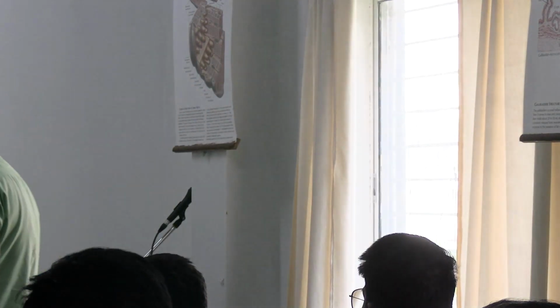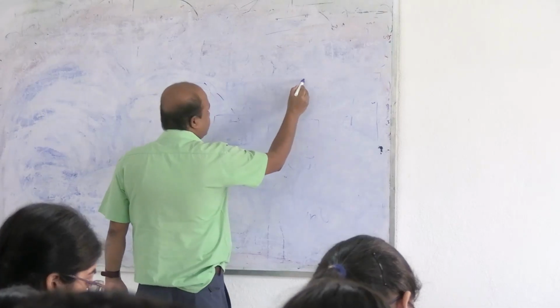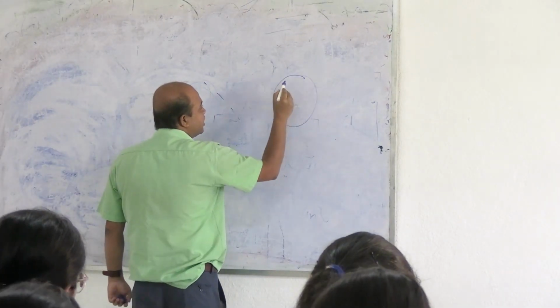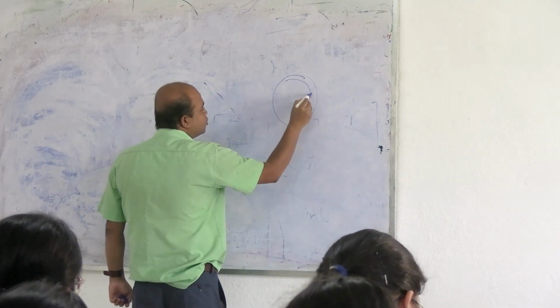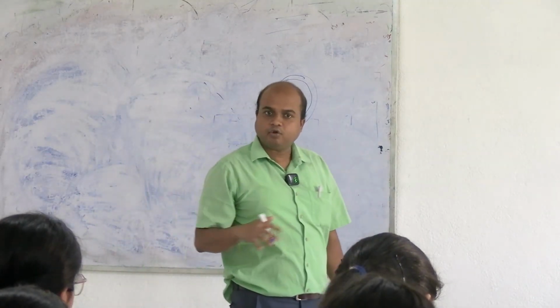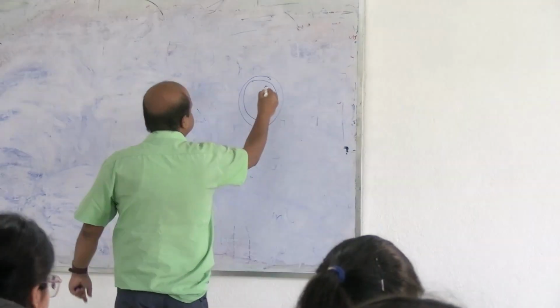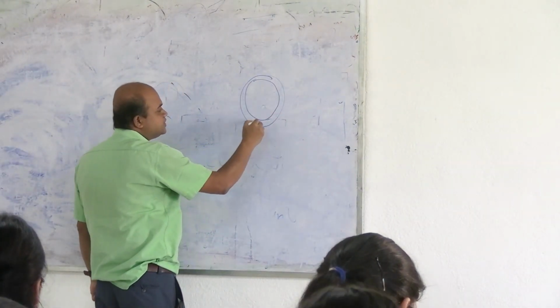It is either neutrophil or eosinophil if there are granules. And in case of lymphocytes and monocytes, there are no granules. Okay. In lymphocytes, it is easy to identify. In lymphocytes, the cell membrane is identifiable, and the nucleus will cover almost the whole of the cell. It will be a rounded nucleus covering almost the whole of the cell, and it is stained deep purple in color.